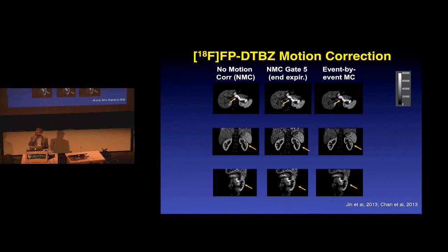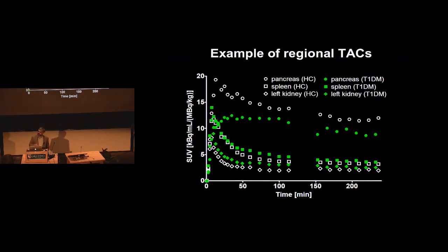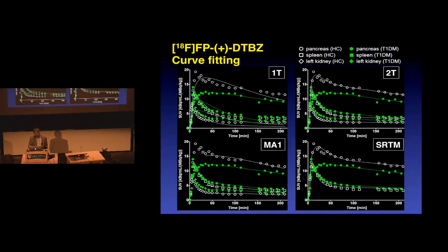A couple other little issues, and there's a lot of these. There's 2 PhD theses and a couple master's theses in this project easily. I mentioned this fitting of data and the time activity curves and all of that. And this is some of that data, and we have to decide how we analyze it. There's lots of these kinetic models that we use. This is an example of a data set. Here's a subject. We kept them in for 2 hours. We gave them a break, and then we let them continue. We got 4 hours of data. I mean, this is clinically impractical. But we tried to analyze that data.